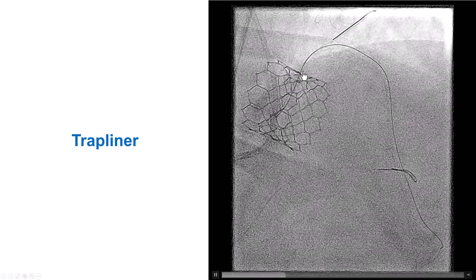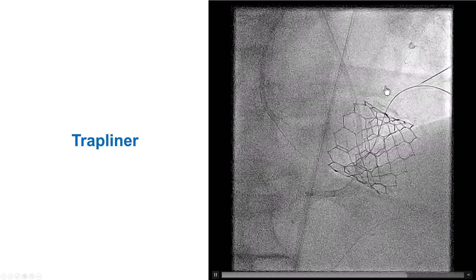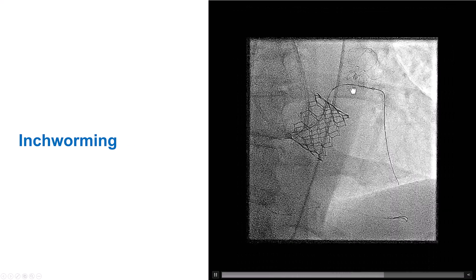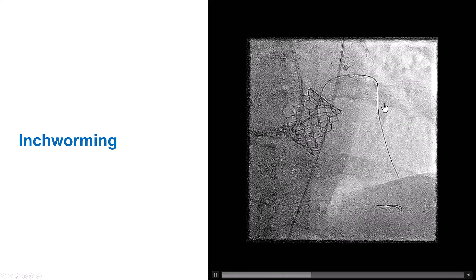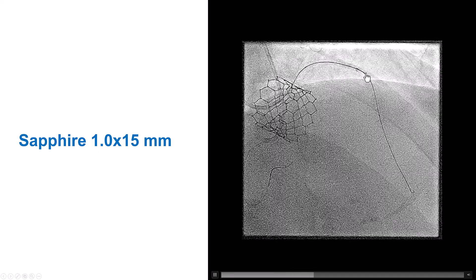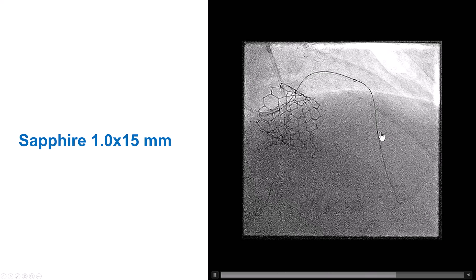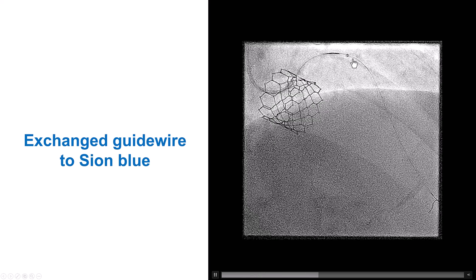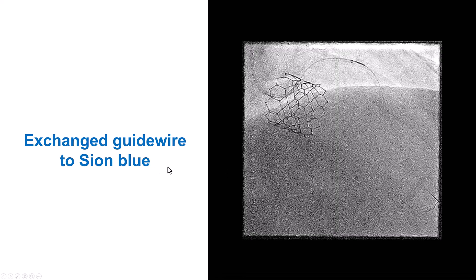The Trapliner had actually fallen outside the vessel, so we had to use various maneuvers to re-engage and get more support. We used the anchor balloon technique with a 2.0 mm balloon, and slowly advanced the Trapliner closer to the mid-LAD, which caused some pressure dampening. After having the Trapliner quite distally into the LAD, we were able to advance a 1.0 by 15 mm Sapphire balloon across the CTO area, pre-dilate, and then advance the Turnpike LP. We then switched the Gaia wire for a workhorse guide wire.